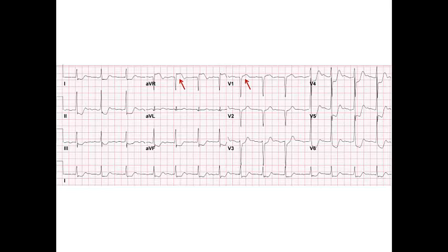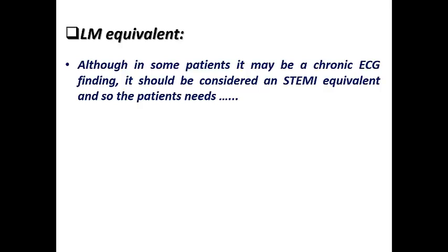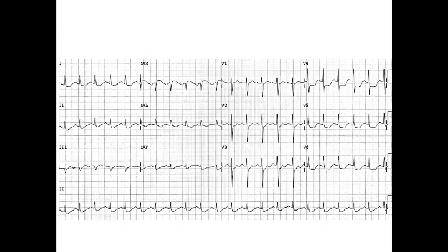Looking at this ECG example, we can see ST elevation in AVR and V1, with ST depression in most inferolateral leads: leads 1, 2, 3, AVF, and V3 to V6 — consistent with left main equivalent. Another example also shows ST elevation in V1 and AVR with ST depression in inferolateral leads, suggestive of left main equivalent. If a patient presents with chest pain and this ECG pattern, they should be scheduled for primary PCI to determine whether there is a culprit vessel occlusion requiring urgent revascularization — not just an early invasive strategy.